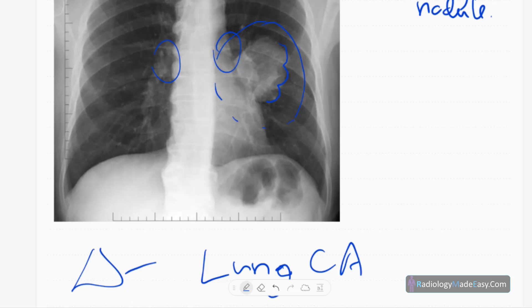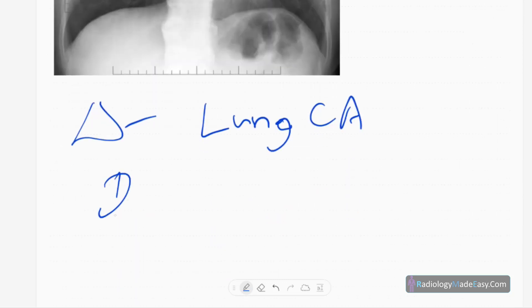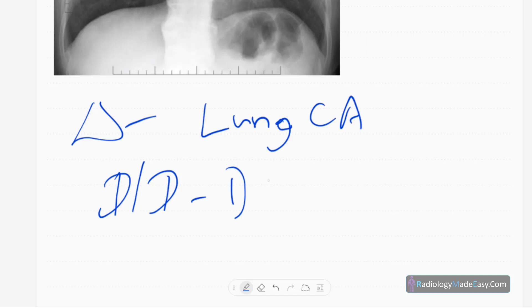To locate the lesion precisely, you need to do a left lateral chest radiograph, which will show the exact position of the lesion and which lobe it is in. Now for the differential diagnosis of solitary pulmonary nodule — one is a hamartoma.